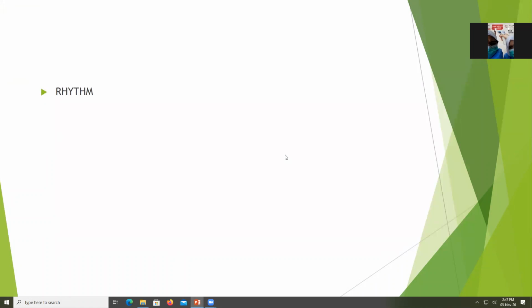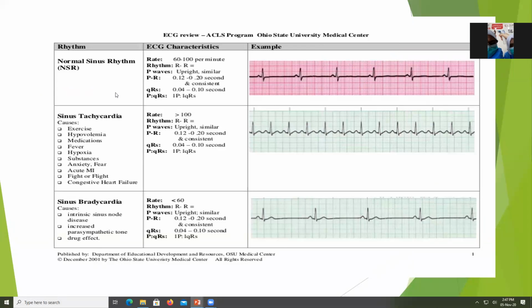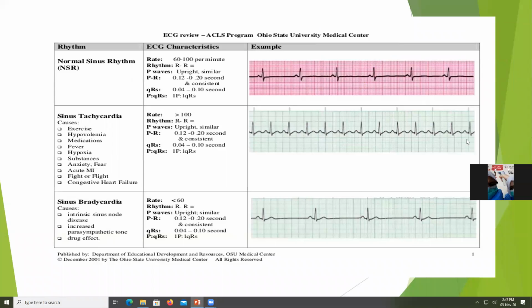So let's discuss the rhythm first. What is rhythm? There are just two things: it could be regular or irregular. If the doctor asks what the rhythm is, it could be normal sinus rhythm, sinus tachycardia, or sinus bradycardia. If the ECG result is normal sinus rhythm, it should be like this. It should be normal.